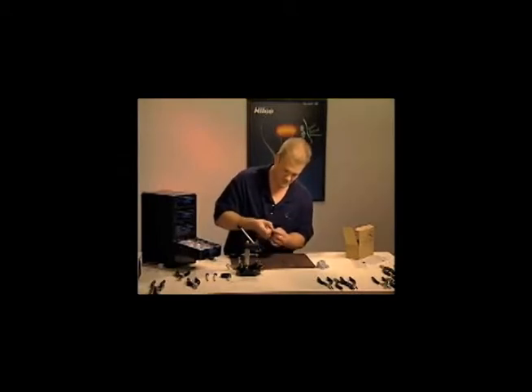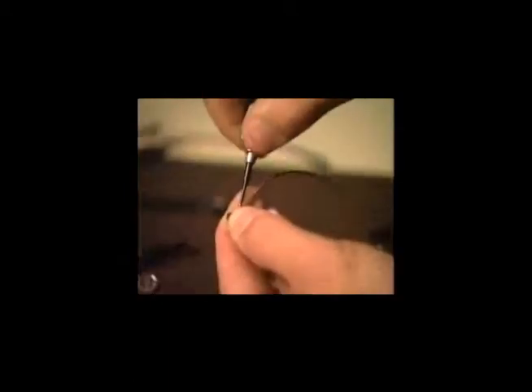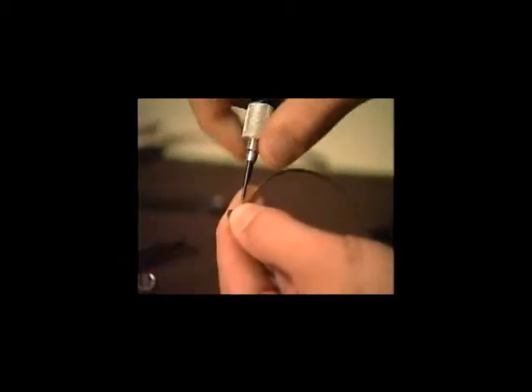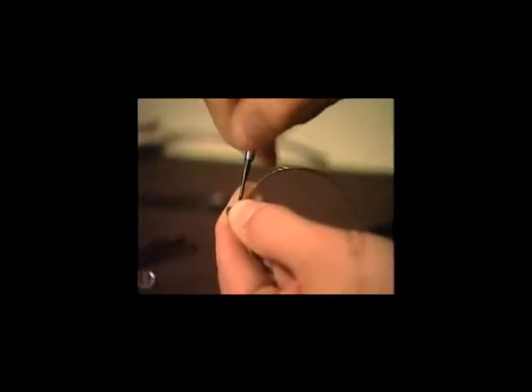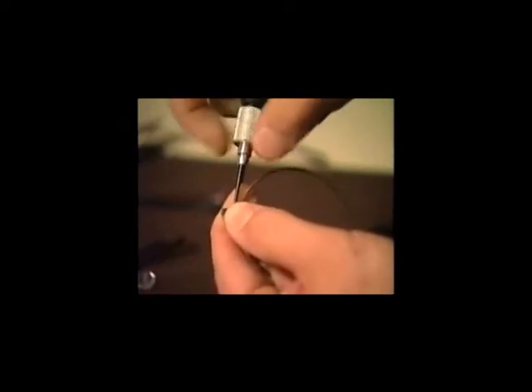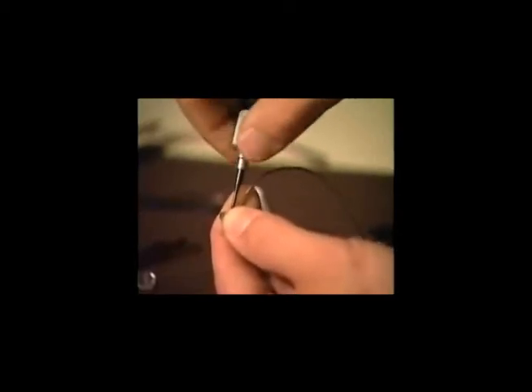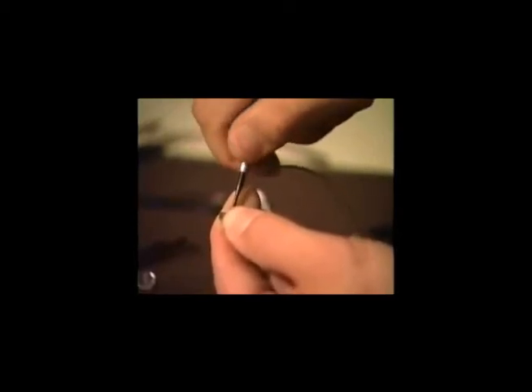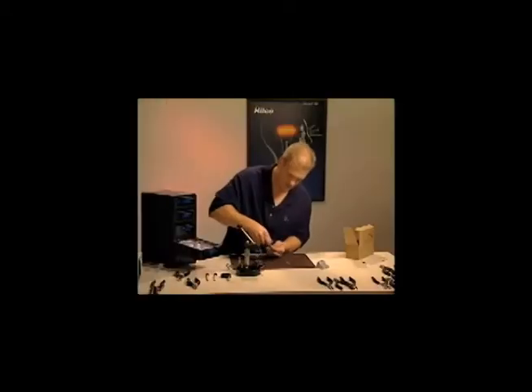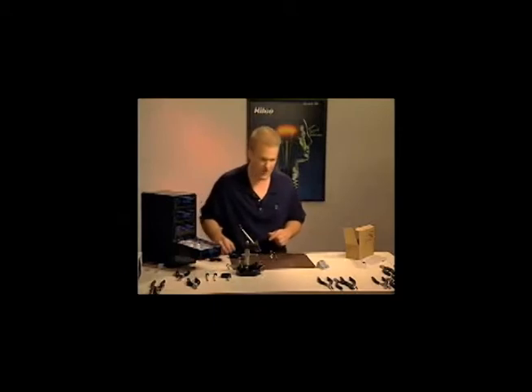Insert that. Yeah, and I can feel it's really starting to cut those threads. Seat it all the way to the bottom. Tighten it down. It's not stripping out. Perfect. So we did have to use a slightly larger diameter size.